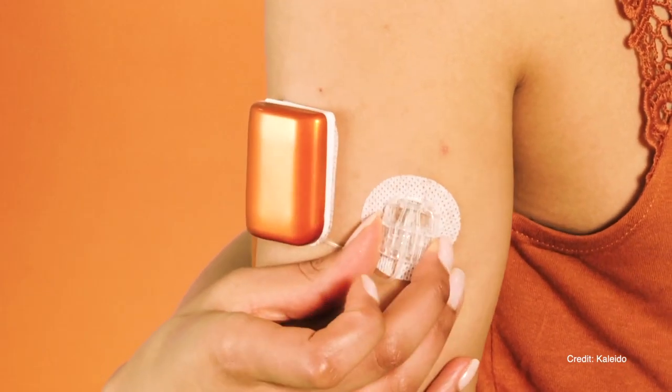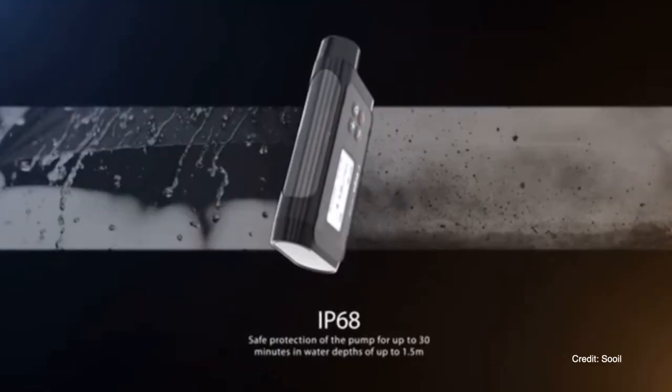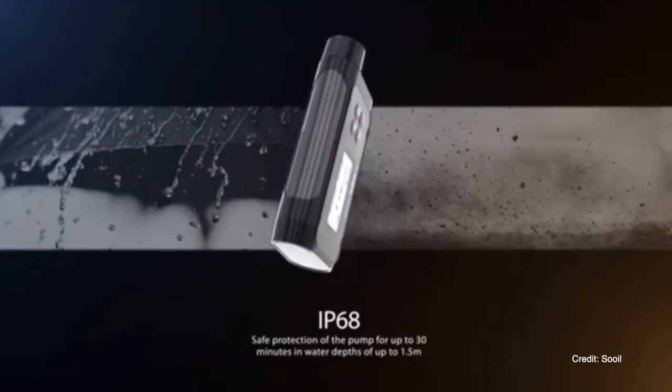It's going to start to adjust. This French hybrid closed loop system is currently in pre-launch in France and is launching in Europe later this year — initially with the Kaleido patch pump, after that with the Dana-i insulin pump, and then with pumps from Roche's insulin pump family. After Europe they will also be launching the DBLG1 system in Japan and in the US.